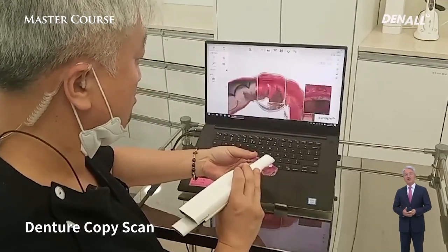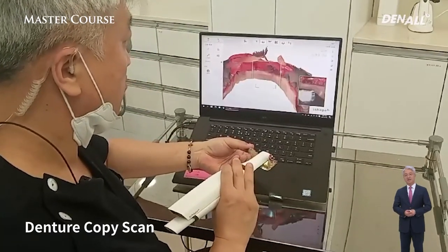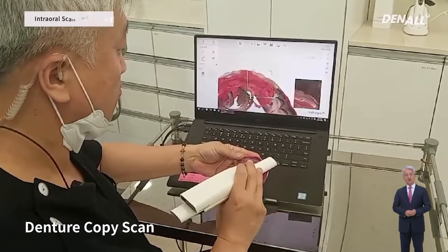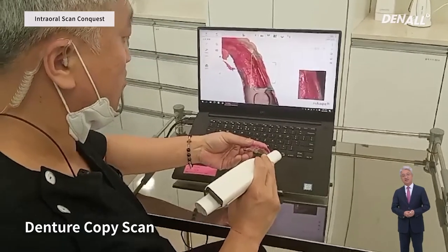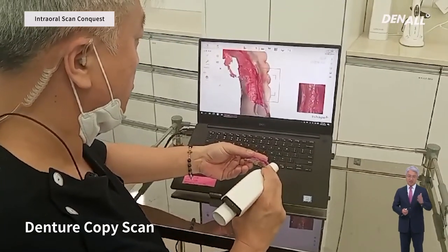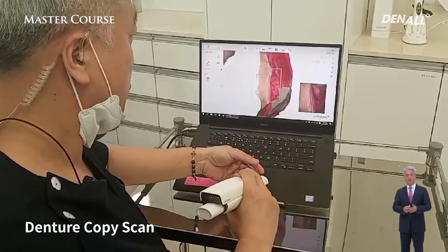If the model scanner is there, you can do a stable scan. Even if you don't have a model scan, if you have an oral scan or extraoral scan, you can scan it and utilize this data. You can adjust the teeth on the denture or the tissue. All of this is possible with intraoral scan.